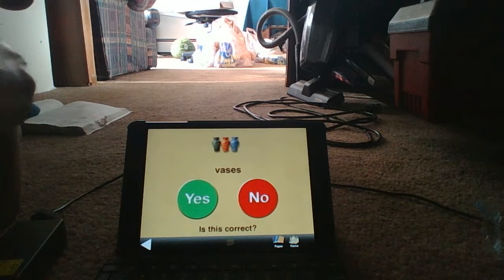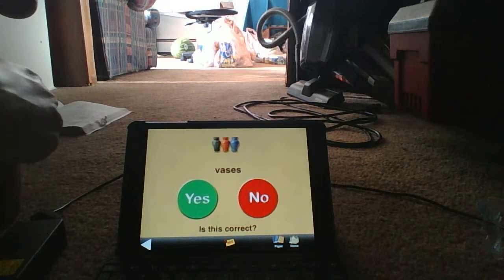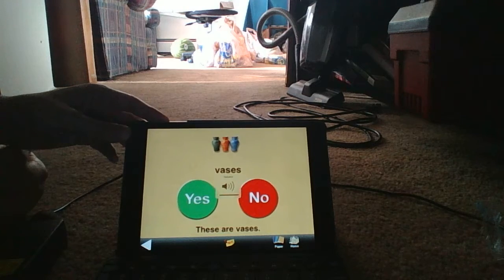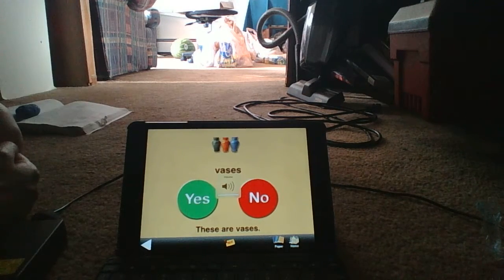So it says yes, no, vases. Is this correct? Let's say I click yes. Now there's a speech output thing going on right now. I should turn that back on, because this is something that Joey would not be doing during school hours.